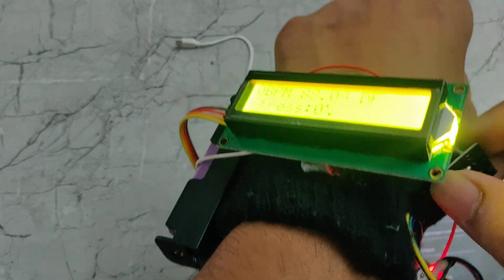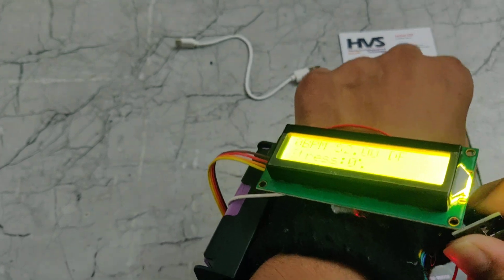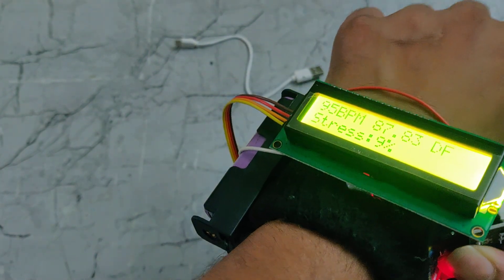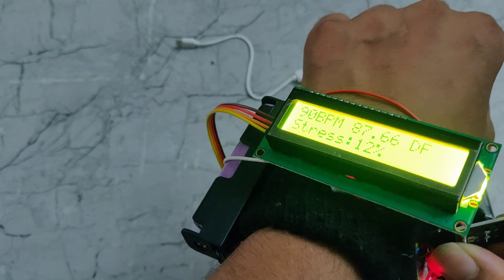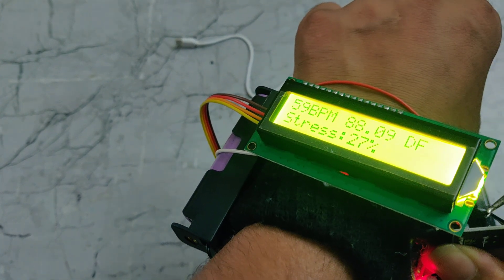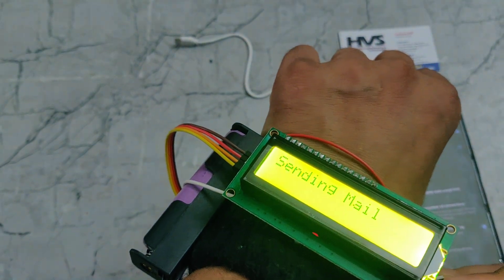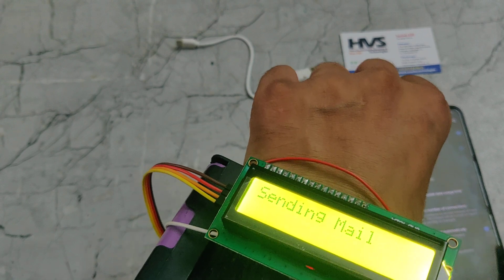Now I am increasing the temperature using a soldering iron. We can see here that the system is now sending an email alert.